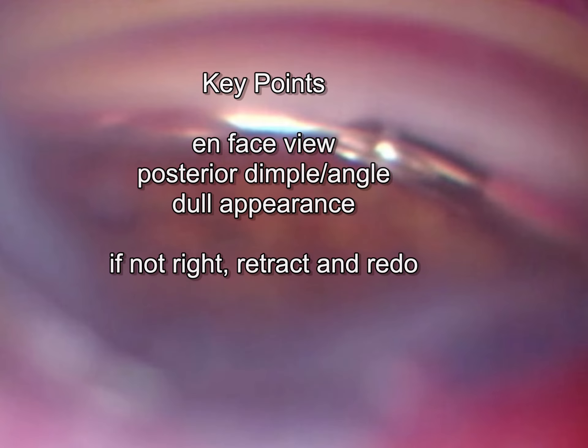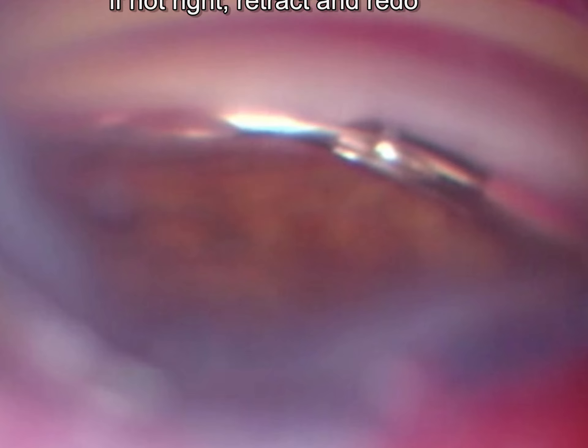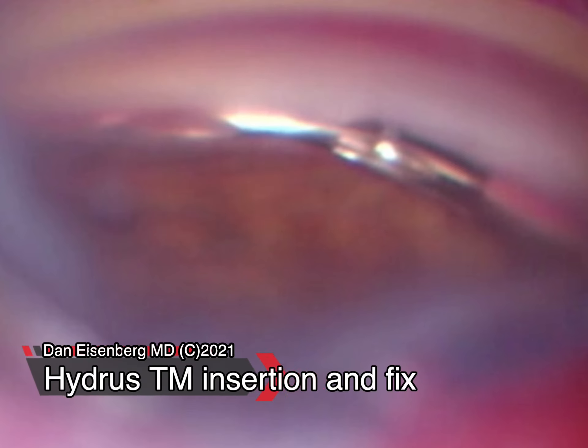Key points: the en face view, the posterior dimple, the angle, and then that dull appearance. If everything's not correct, just stop and do it over. Thank you very much, and I hope you enjoyed this video.